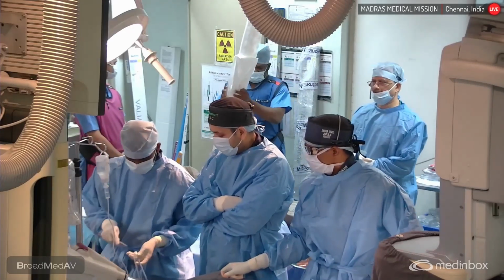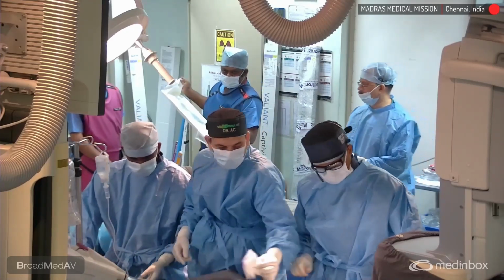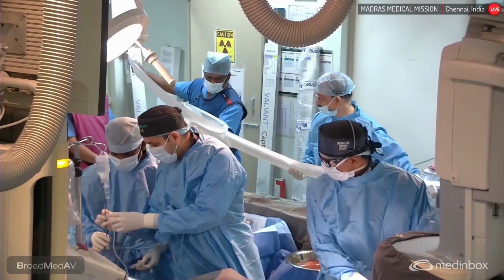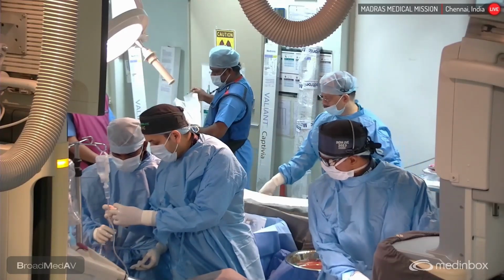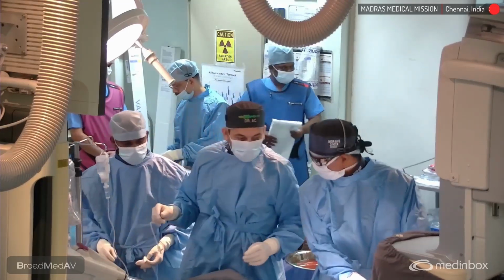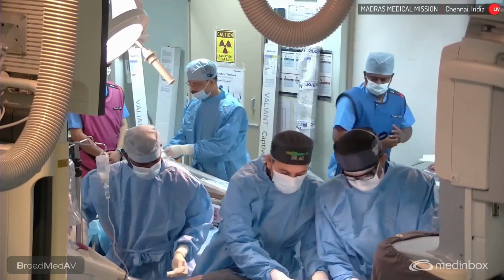After this, give me a JR or pigtail, whatever it is. You are ready, Ashish? Ashish, you are ready?